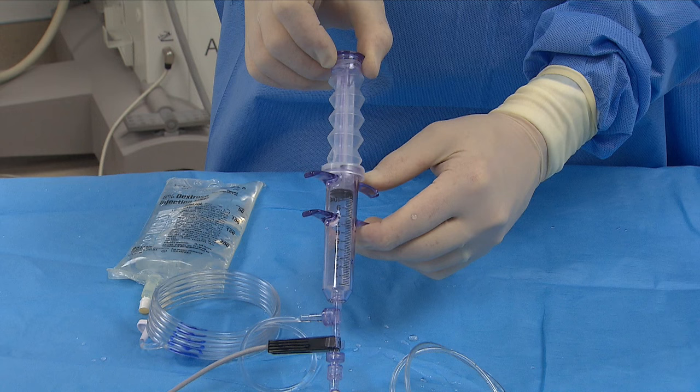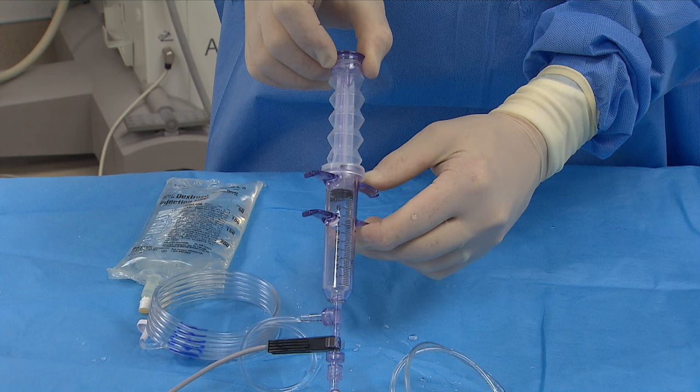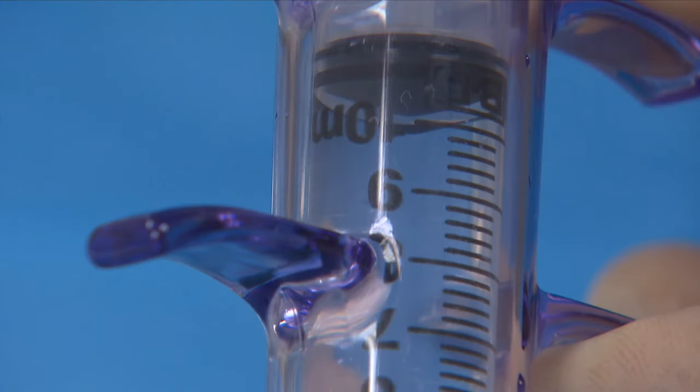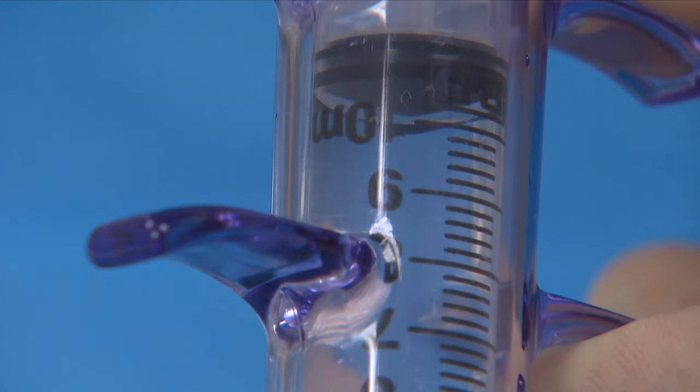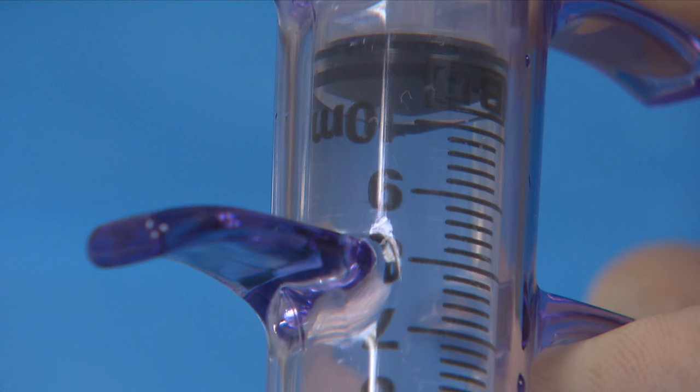Finally, ensure that the appropriate conversion factor is entered into the computational monitoring software to ensure an accurate cardiac output reading. This number is generally found on the PA catheter packaging. Because thermodilution is dependent on injecting a known quantity of solution into the pulmonary artery, it is important to ensure that exactly 10 mL of solution is drawn into the syringe for injection.